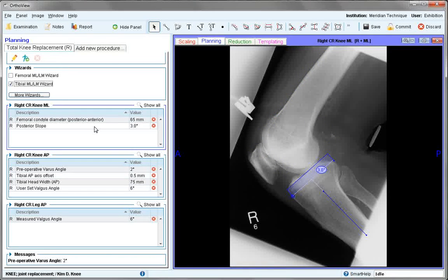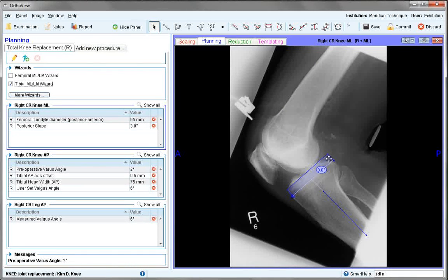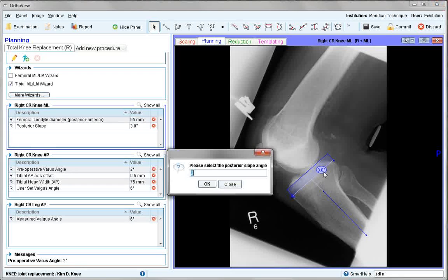The tibial wizard is used for positioning only and is aligned to the anatomical axis, with the rectangular box over the extent of the tibial plateau. The three-degree value can be altered for posterior slope by clicking on the meter or by setting it in preferences.